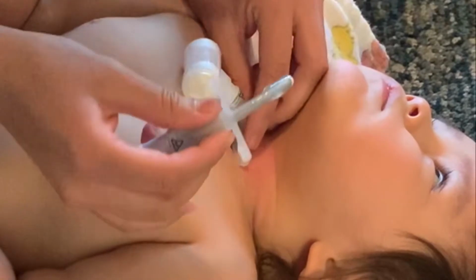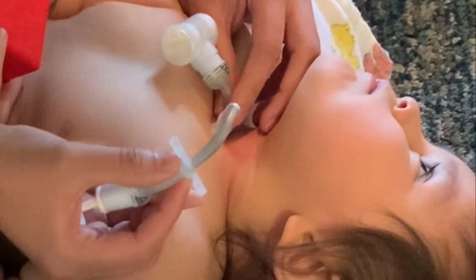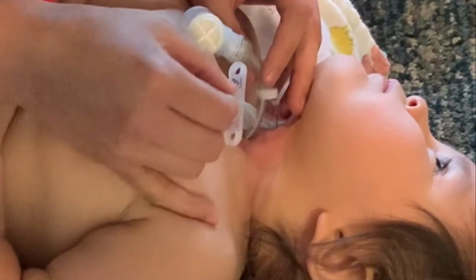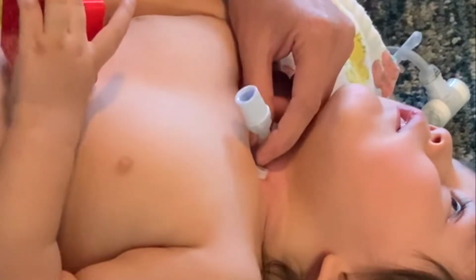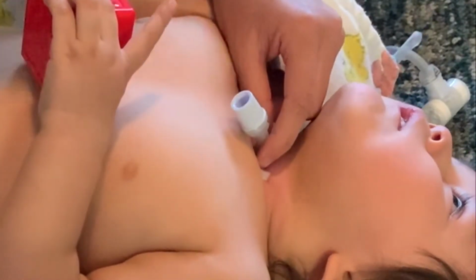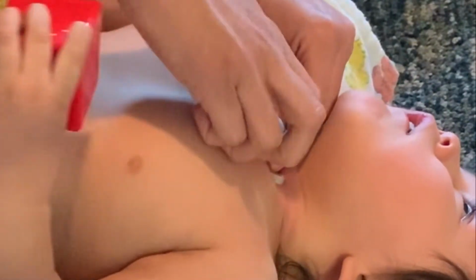I'm actually lubing up the new trach right now, and we are going to swap this out in a little bit. I personally like to use a lot of lube, that way the insertion goes much more smoothly. And there you see it. I then put the new trach in, take out the obturator. The obturator is a rod that goes inside the trach, and it makes the insertion that much easier.